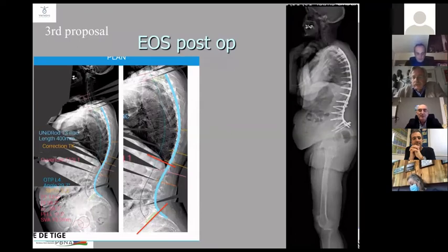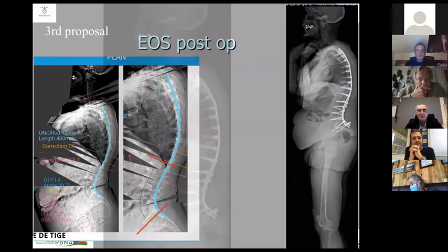I'm not trying to put all the patients in the same box. So the pre-op examination is very important. And for this patient here, I show you this was a pre-bent rod that we got for the surgery, and this is exactly what we got after the surgery. So when the planification is well done, the osteotomy is planified at the right level, you really have a good outcome.